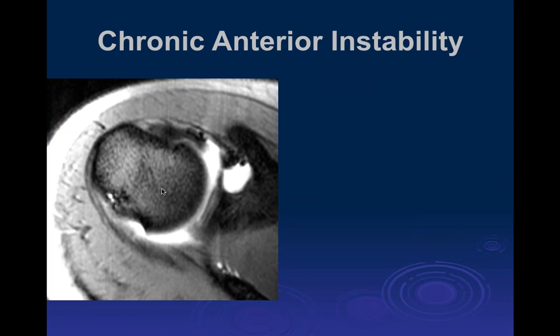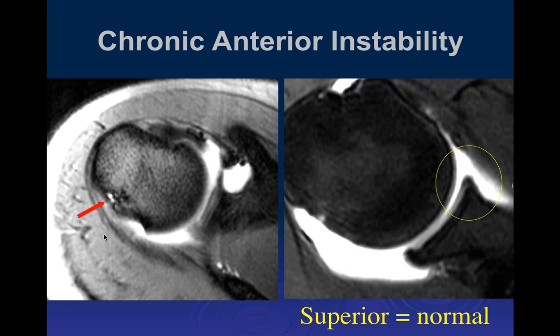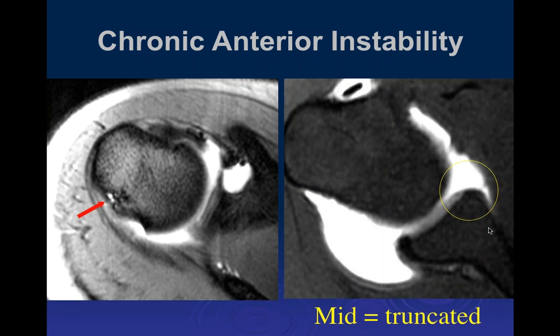And here's a patient with chronic anterior instability, and we see a lot of irregularity of the posterior aspect of the greater tuberosity. Here, the labrum looks pretty normal superiorly, but if we go inferiorly, it's markedly truncated. This looks like a chronic lesion, and this is the appearance of a chronic long-standing anterior labral tear, where a lot of the labrum just gets resorbed. In this case, the articular cartilage is intact, but you have a chronic anterior labral tear, and that leads to the patient being unstable.